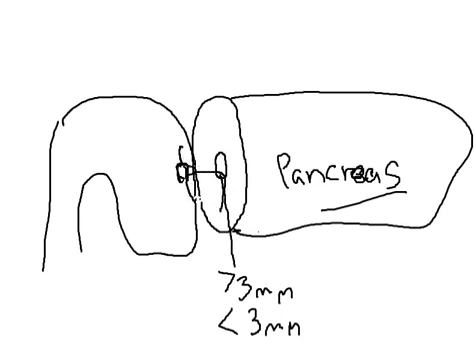I tend to use more sutures than other surgeons and approximate it very well. It's important to take deep bites in the pancreas with the needles. I do not place a pancreatic stent in the majority of cases, only if I'm not happy with one particular aspect of the anastomosis. Only then may I place a stent.